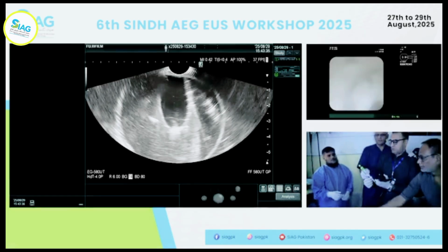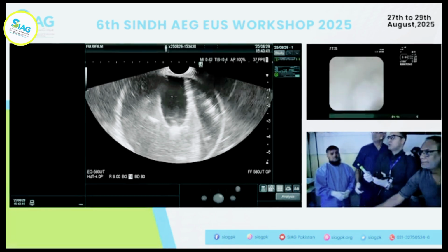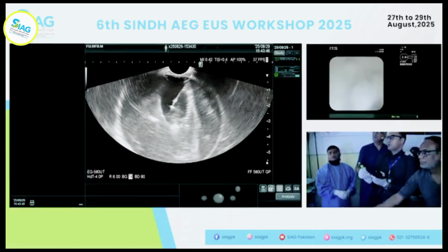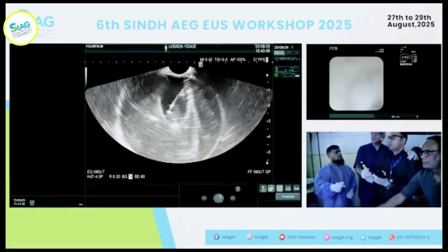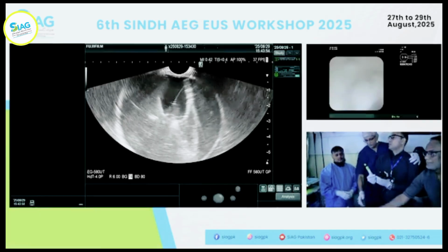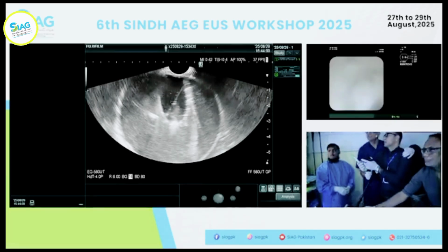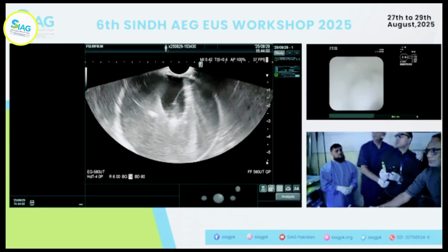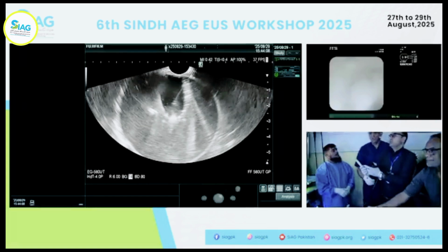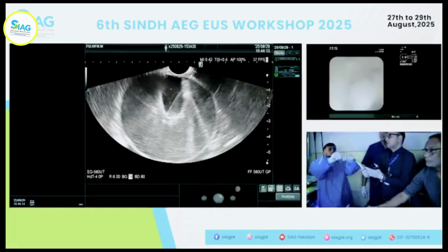Okay. Now you undo this. You can remove this a little bit. Now go in. Yeah, go. Okay, keep going. So you can see when you're doing biopsy, you can go all the way. Now how do you just keep this needle here, and the needle, if your scope is not like this, look, if the scope is actually moving with your hand, then you can actually see it better, or you can actually lose it. Okay, so that's the shoulder movement we were constantly talking about. Got it? And now you take this out, which is your stylet, and put a syringe.